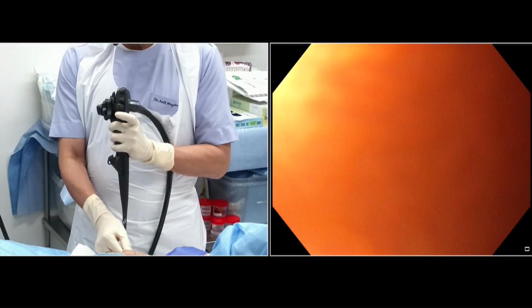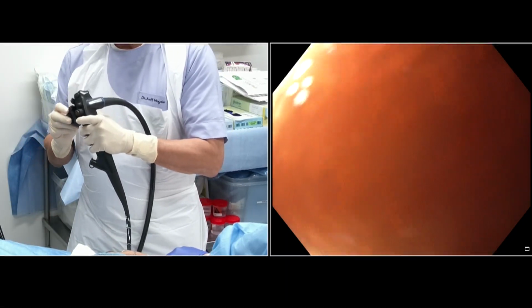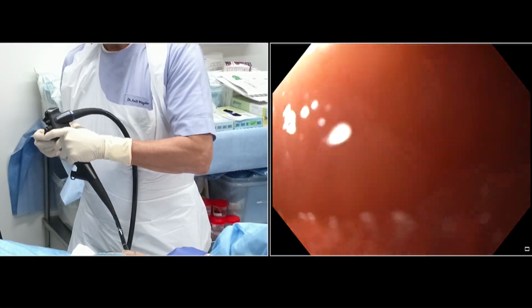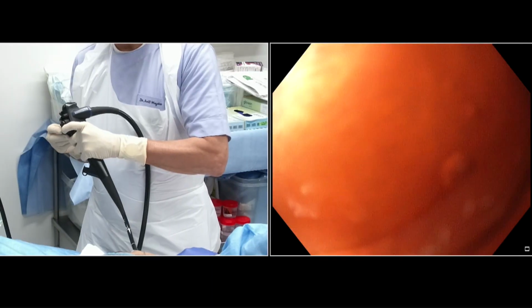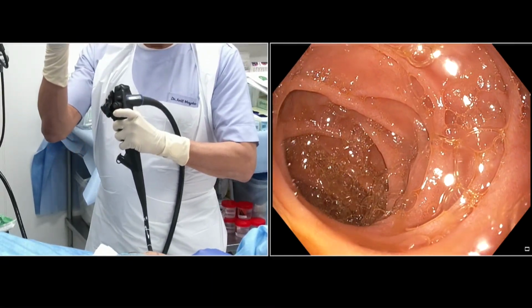So pass the scope a little bit in, and now I am turning the small wheel to the right, body to the right, and the big wheel gently up. See what I have done? Small wheel right and big wheel up. And by doing that, I enter the second part of the duodenum. This is the second part.